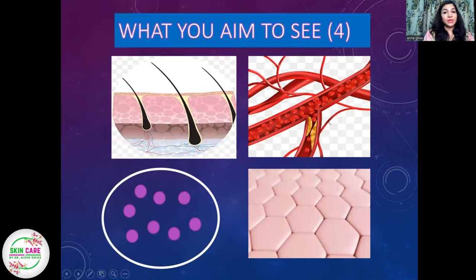This is something which is very important and usually residents tend to forget about it. So the blood vessels are very important whenever you're writing down a trichoscopy report or you're looking for some diagnosis in the hair disorders. You have to particularly pay your attention towards the presence or absence of any blood vessels in your field. All right, the skin, this is the right lower corner picture.